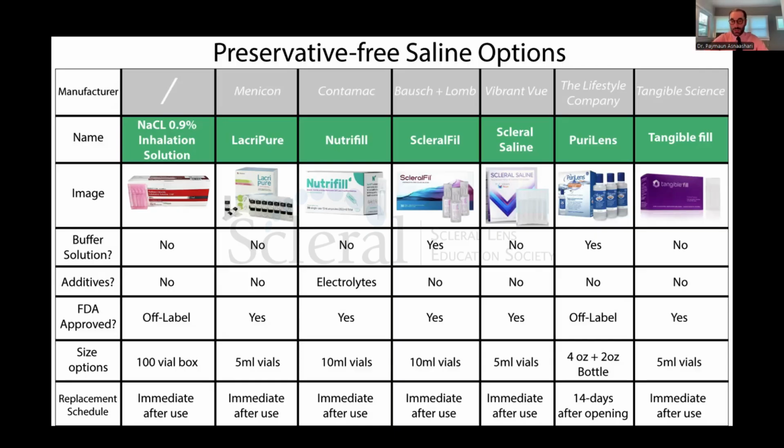And then these are just different saline options. So if you have a patient that's having fogging issues, have them try potentially something else. See if they react better to it. So anyhow, I think this is a nice slide to show all the saline options that are out there.